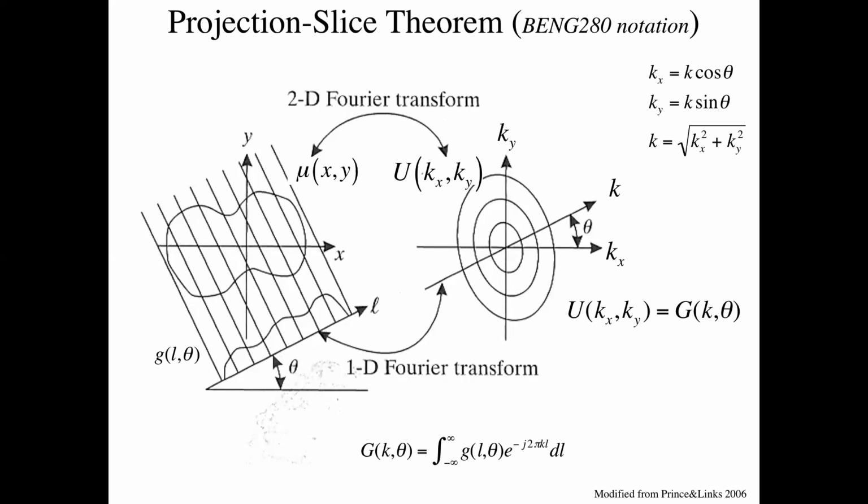I don't know if that's intuitive to anyone here, and if you can explain it with intuition, I'd love to hear it. It's not that intuitive to me, but I guess it makes some sense in that all of the information integrated down here is lost into a specific sort of integration of buildup here. So anyway, this is called the projection slice theorem.